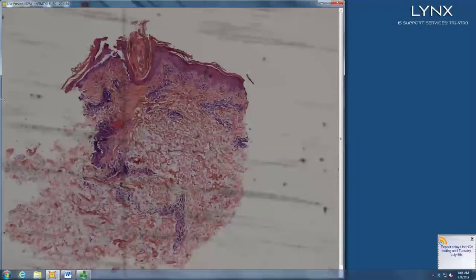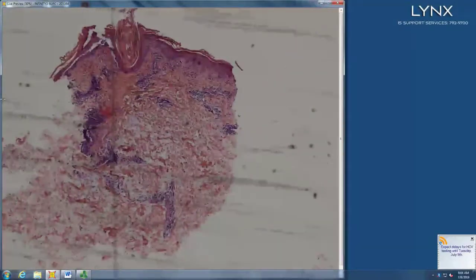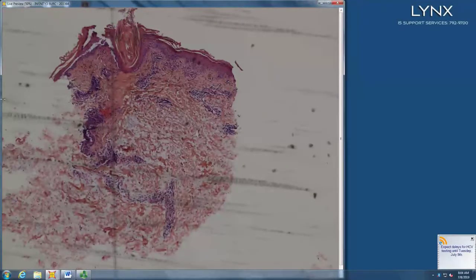So we have a punch biopsy. There's some infiltrate that's more in the superficial dermis as well as the deeper dermis. So it's patchy, perivascular, and also what part of the follicle? Is it more up here, down there, or in the middle? More like isthmus. What likes the isthmus? Lupus. Does lupus give you follicular plugging? Yes, it does. Interface dermatitis? Yes. Mucin between collagen bundles? Yes. I think we're there. So, lupus.